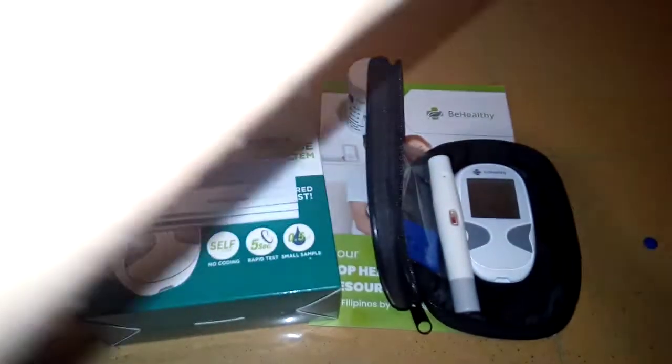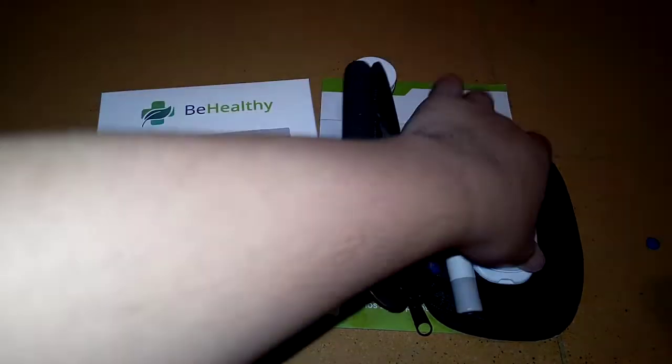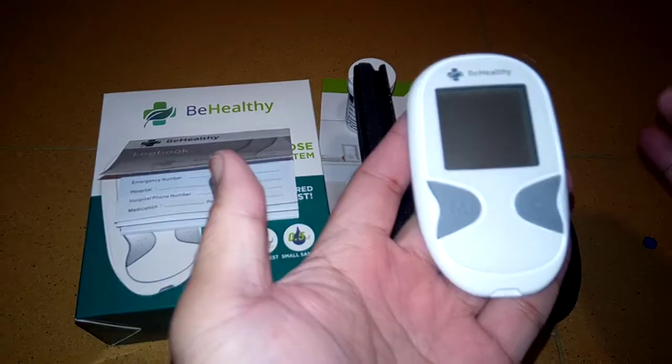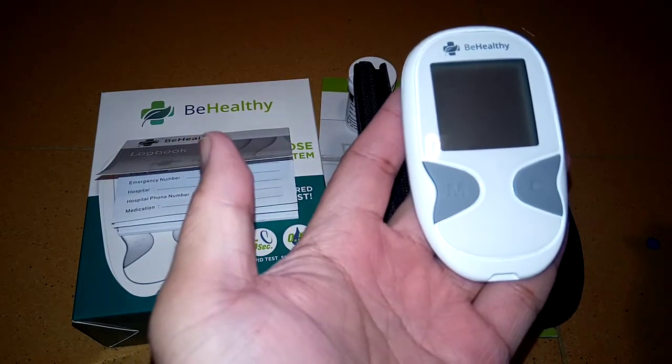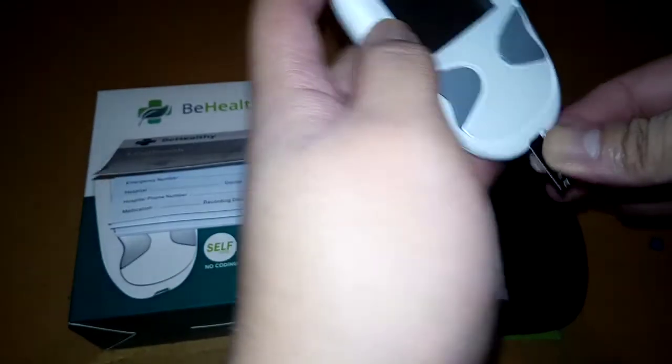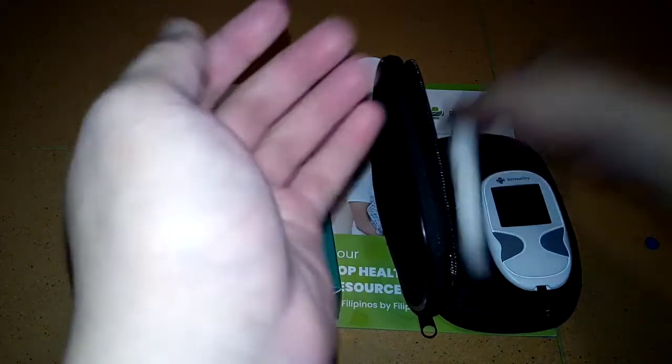Now let's insert the test strip. Make sure your hands are clean so it won't be contaminated. What's also great about this machine is you don't need to enter a chip code — it already has a built-in code. Let's see how it works.